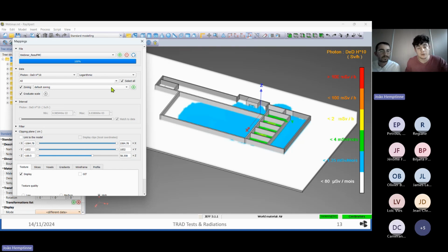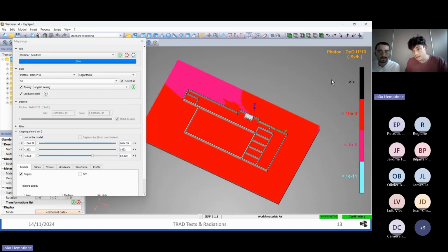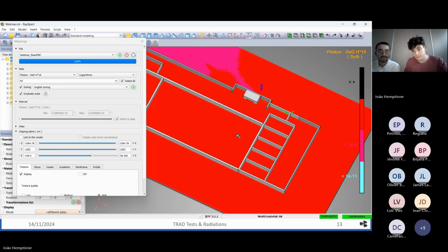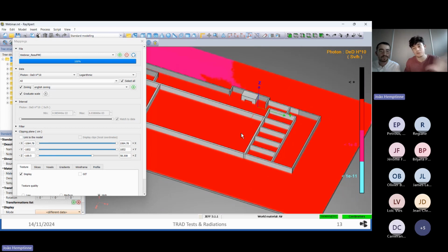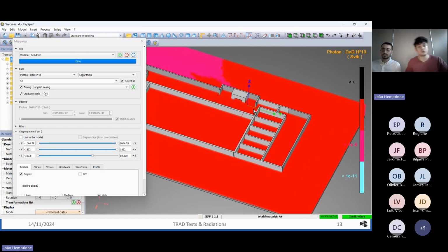And when your zoning is set, it is available in the list right there. As you can see here, you got the zoning that I just set. It was just an example, so the values are not accurate, but it's in order just to show you.